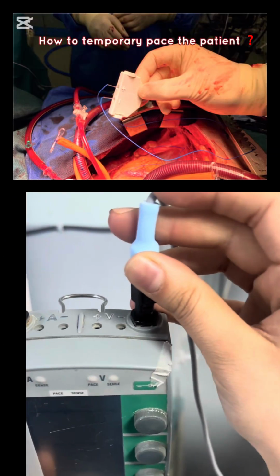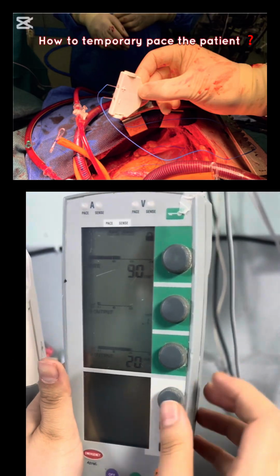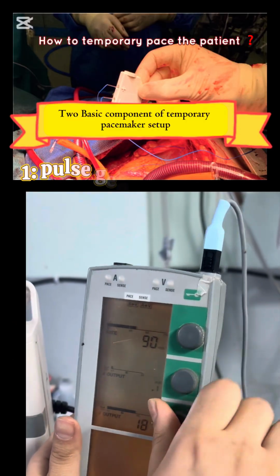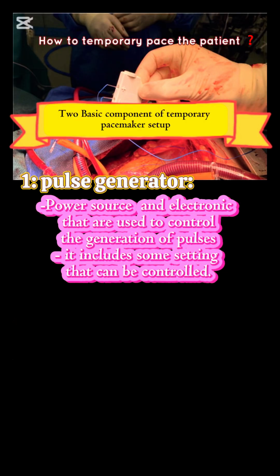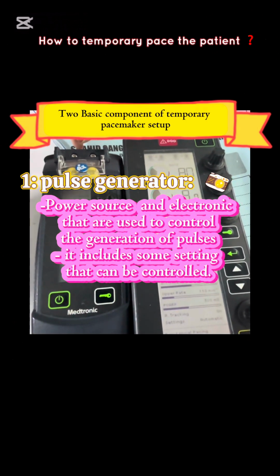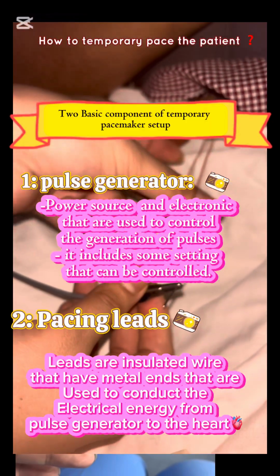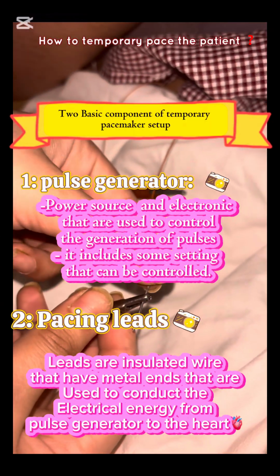How to temporarily pace the patient? Before entering into the topic, you need to know the two basic components of a temporary pacemaker setup. One is the pulse generator, that means the power source and electronics that are used to control the generation of pulses, and it includes some settings that can be controlled. Another component is the pacing lead. Pacing leads are insulated wires that have metal ends and are used to conduct the electrical impulse from the pulse generator to the heart.